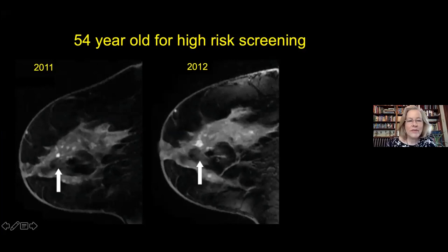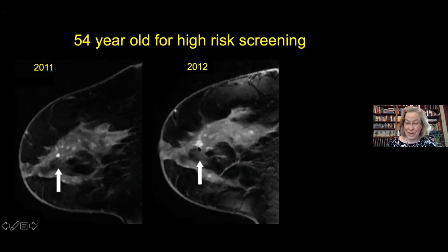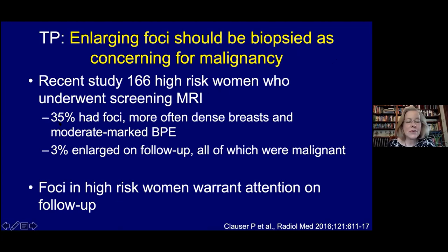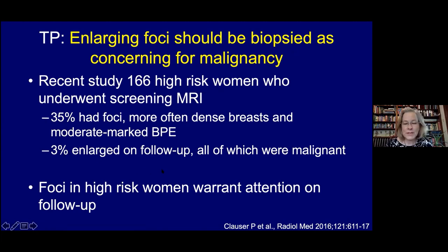A 54-year-old had a focus that somebody called benign because other foci looked similar enough. On follow-up a year later, it had gotten bigger—this turned out to be an invasive ductal cancer. Enlarging foci, particularly in high-risk patients undergoing annual MR for screening, should really be biopsied. A recent study of 166 high-risk women found about a third had foci—more often in those with dense tissue or moderate to marked background enhancement. Of those 35%, 3% enlarged on follow-up, and in all those that enlarged, they were cancer.